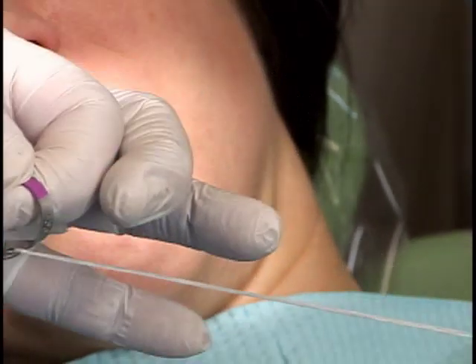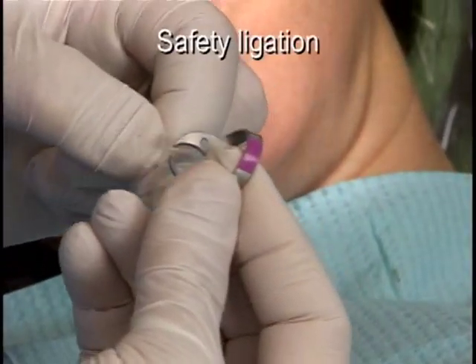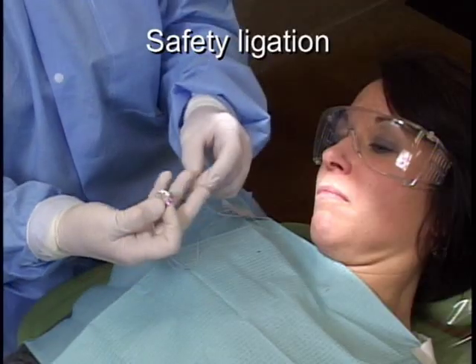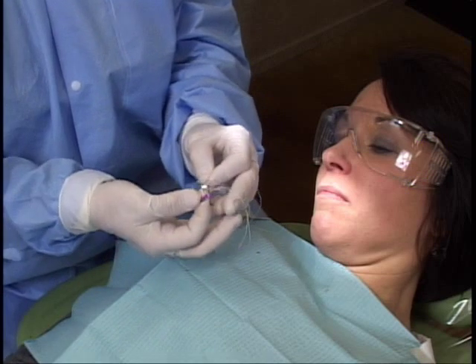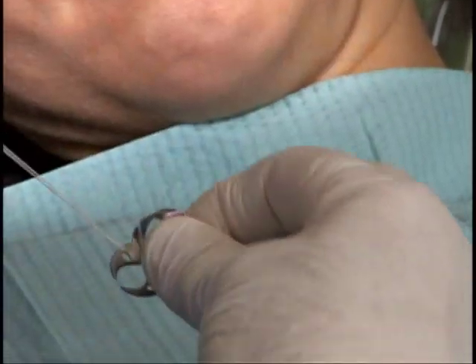Before placing the clamp, it is recommended that a piece of floss be tied to the clamp. This is known as a safety ligation and provides a means of retrieving the clamp should it become dislodged. Engaging the clamp with floss through both holes ensures complete retrieval of the clamp.